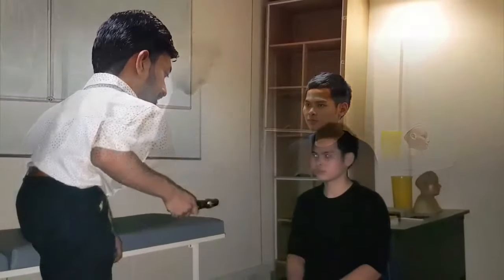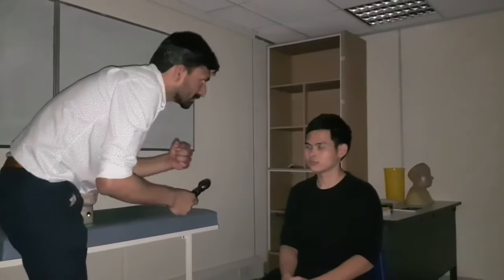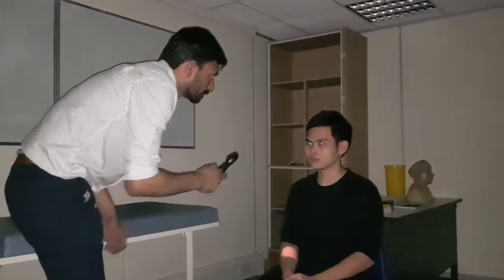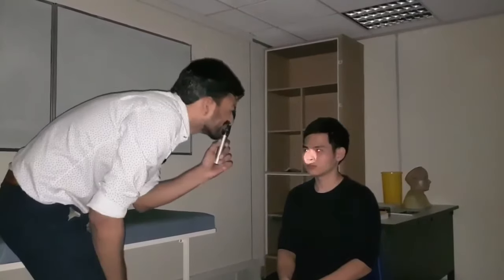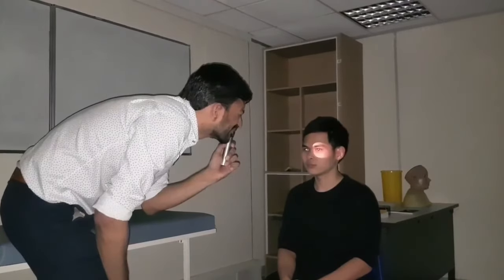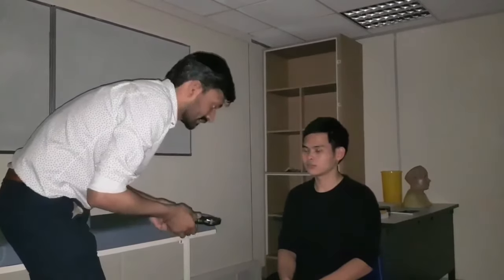I want to dim the light. Could you please look straight at the wall? Okay, thank you. You can relax.